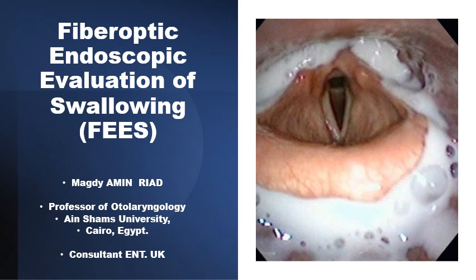Fiberoptic endoscopic evaluation of swallowing (FEES) is a standardized and validated technique that, together with video fluoroscopy of the pharynx and upper esophagus, constitutes the cornerstone in the diagnosis, planning of the management, and follow-up of cases of functional dysphagia, particularly pharyngeal and upper esophageal dysphagia.